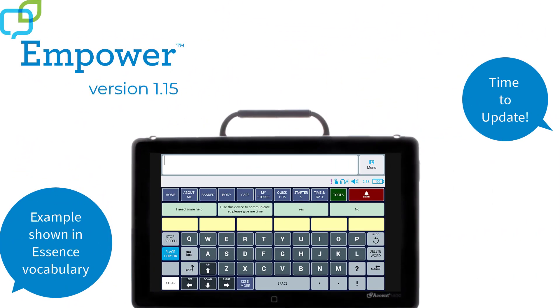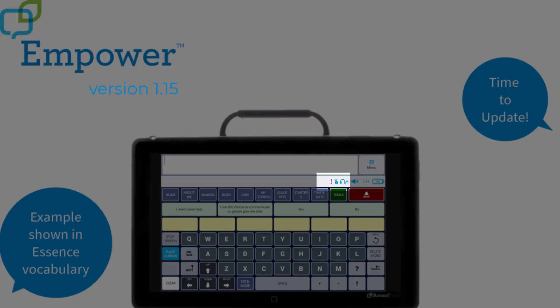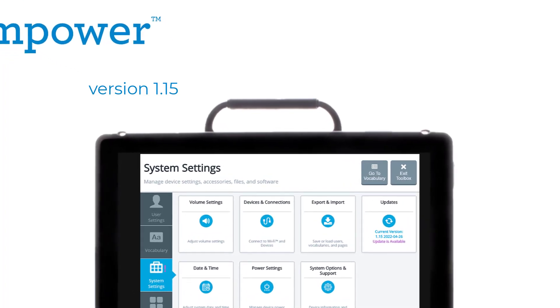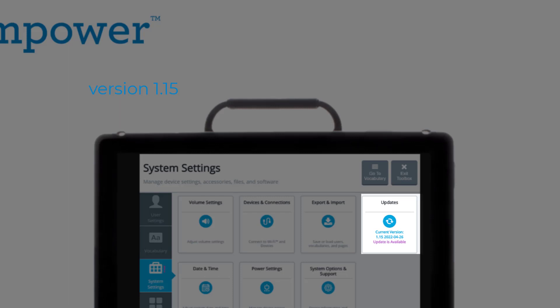Not sure when to update your Empower software? Now we have an auto-check and notify feature for software updates. When an update is available, you will see a purple exclamation mark in the multi-bar status area of your vocabulary. To install the update, you'll go to System Settings and the tile that says Updates, where you'll see your current version and a notification that a software update is available. Follow the on-screen prompts after you select this tile to complete the update.